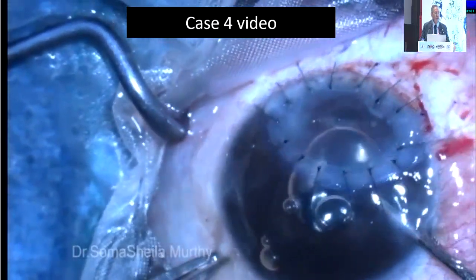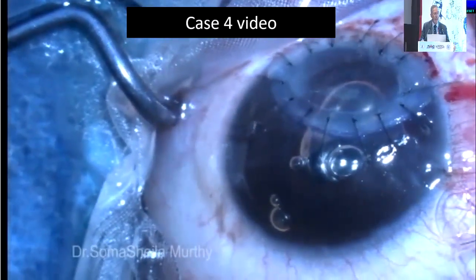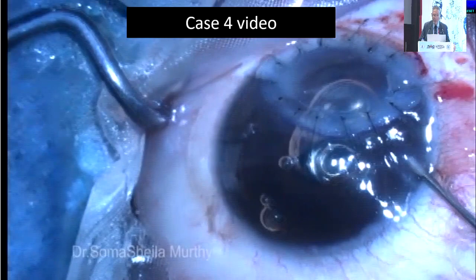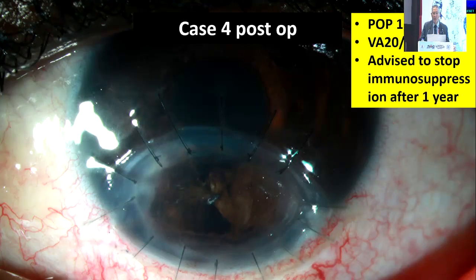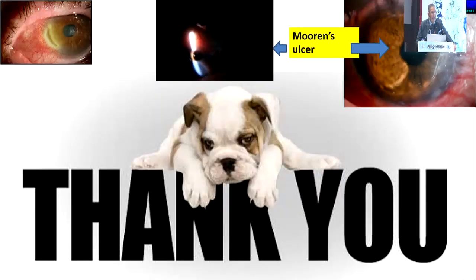So you're making sure that the chamber is formed in the area where you put the patch graft, that there are no synechiae there. And then air will ensure that it remains a good chamber for at least a couple of days before the aqueous takes over. So post-op again, this patient did reasonably well. You could salvage this eye, and the immunosuppression could actually be stopped after a year. This patient then developed a cataract, which was then operated. And the patient did see well.